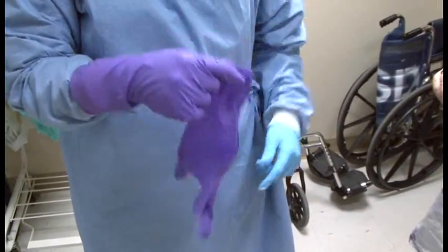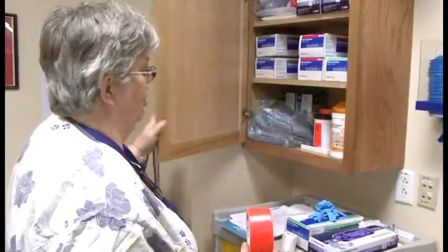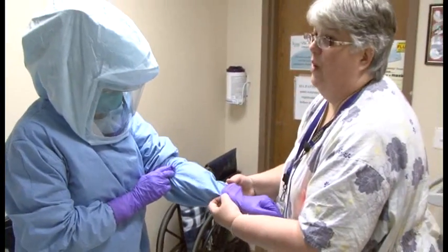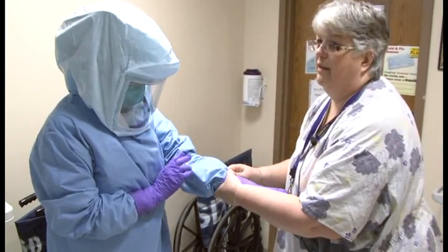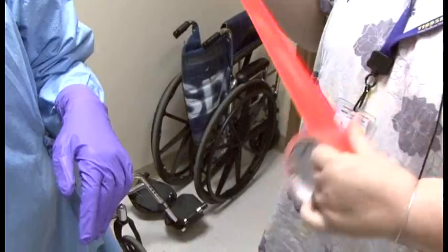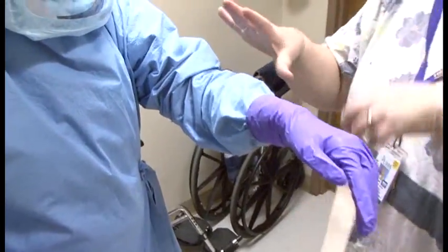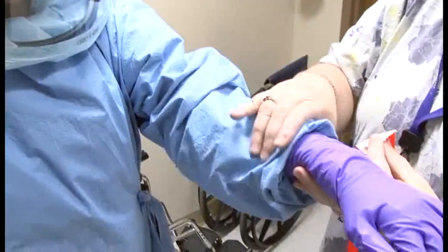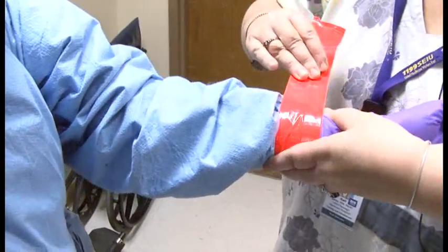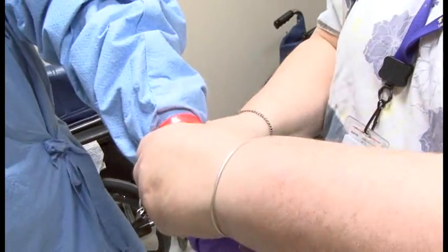Once both gloves are on, the observer applies duct tape — bright orange duct tape located in your supply cupboard. Smooth out any bunching of the gown first, then apply the tape and check that it is secured all the way around. Then create a little fold in the tape so it will be easier to remove when coming out. Repeat on the other arm.